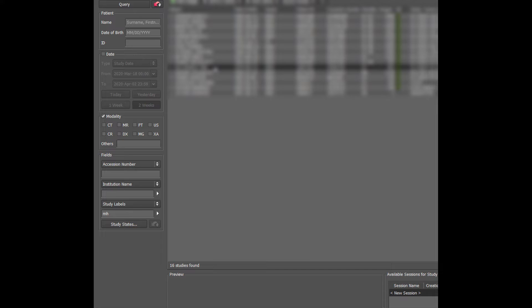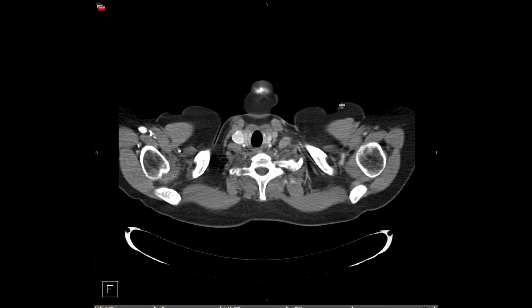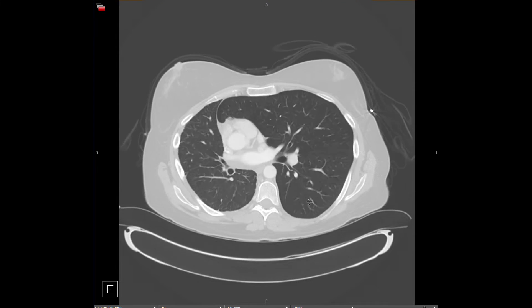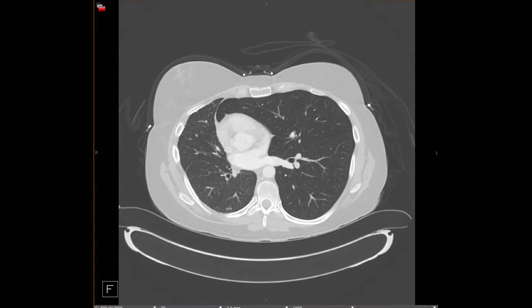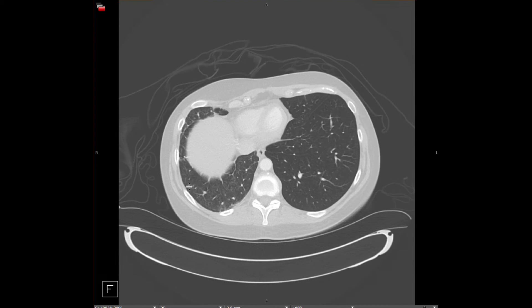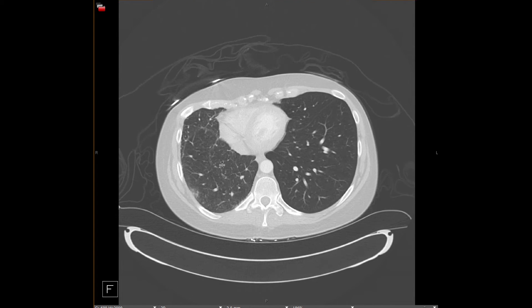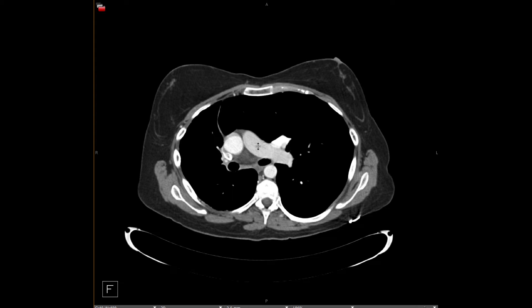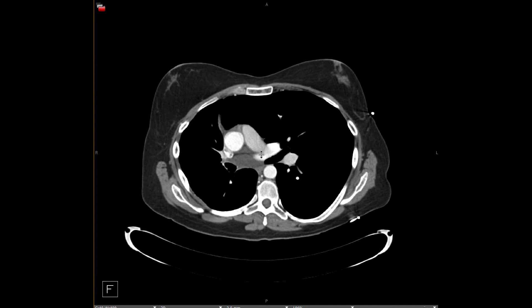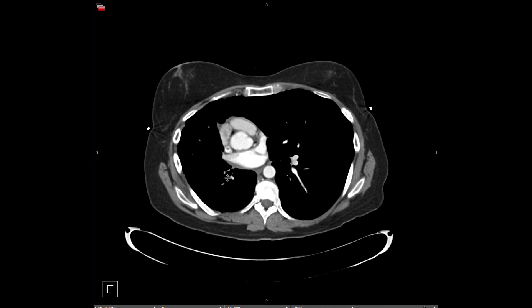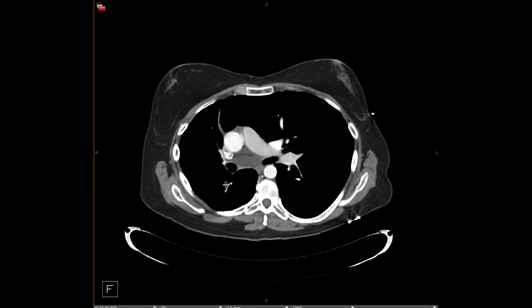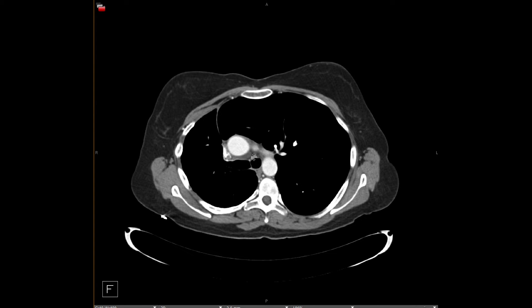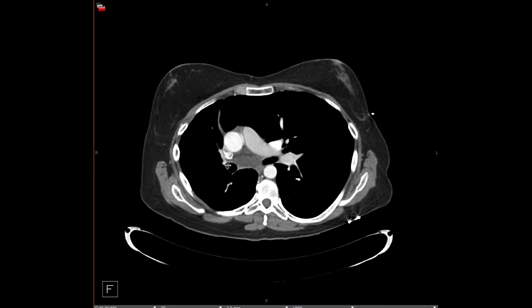Next is pulmonary artery agenesis. On lung windows the right lung is small with abnormal vascularity, some areas of scarring, and subtle thickening — it looks like a scarred lung. On mediastinal windows there are normal main and left pulmonary arteries, but the right pulmonary artery is entirely absent. All the vascular supply to the right lung is fed from bronchial collaterals, which you can see extending into the right hilum.